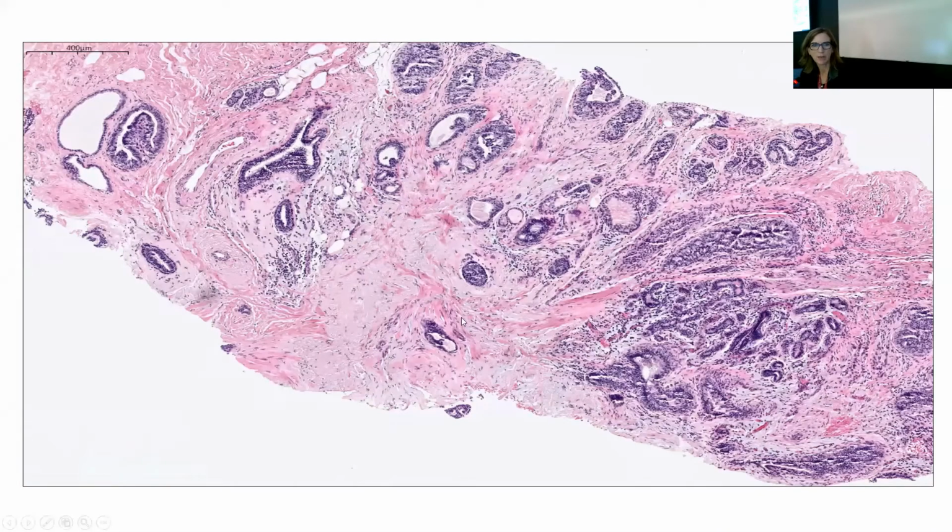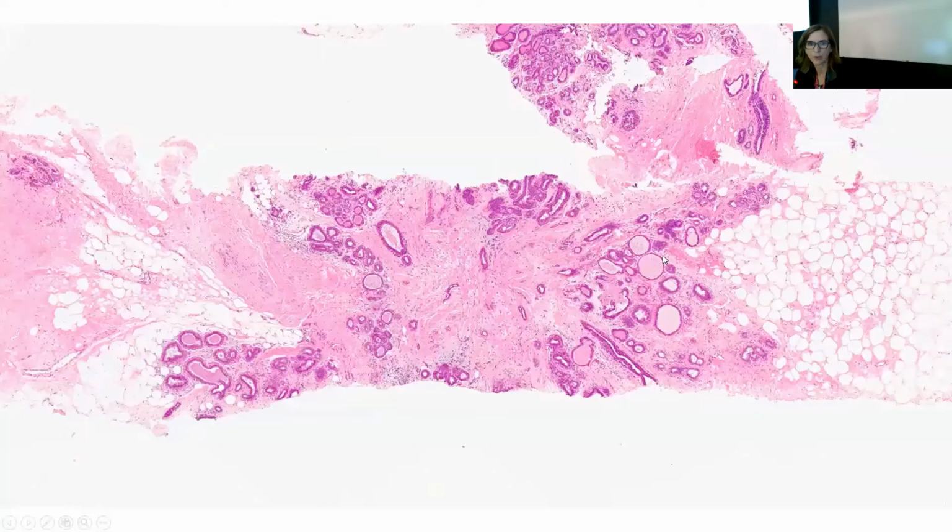So this may be one of the slides I showed in the earlier session, where you have this elastosis, you have some entrapped glands, you have epithelial elements radiating out. And so when you see that kind of radiating process with the central elastosis, you should think about radial scar, and then obviously evaluate the epithelial proliferation based on the criteria that we've both been speaking about to help you recognize it as a benign process.